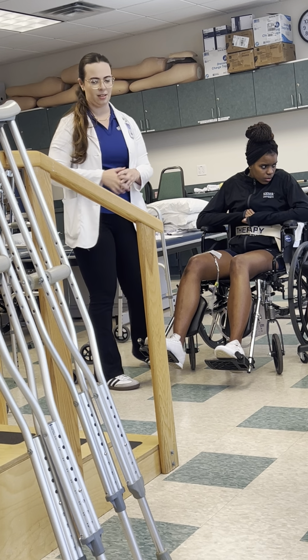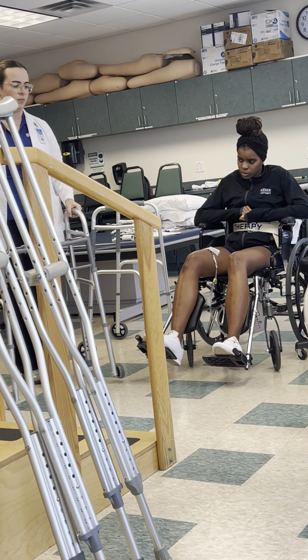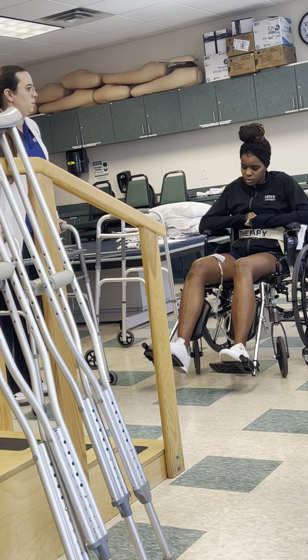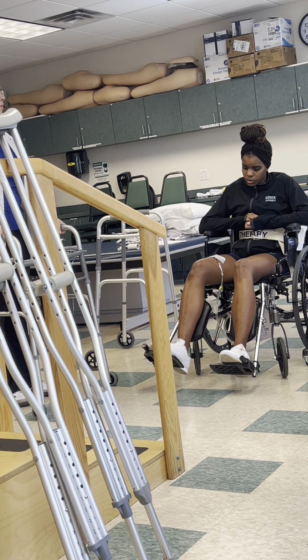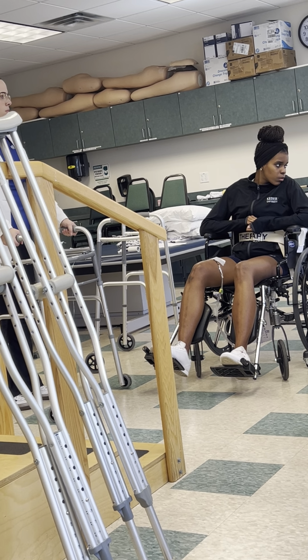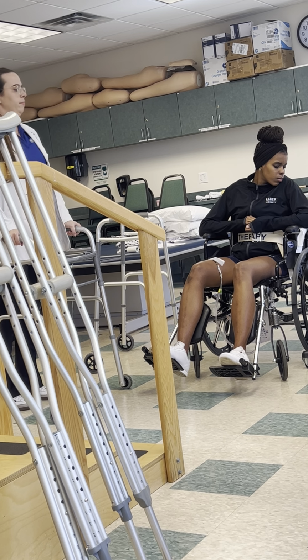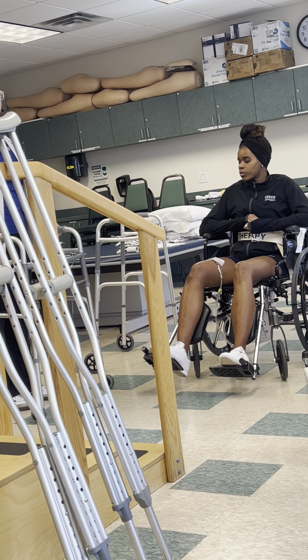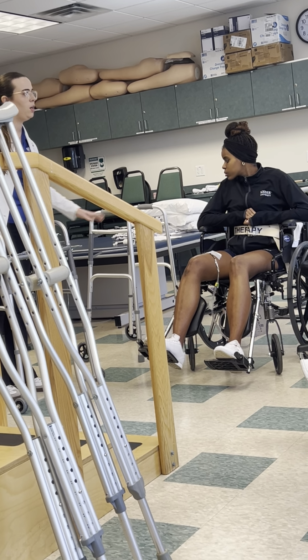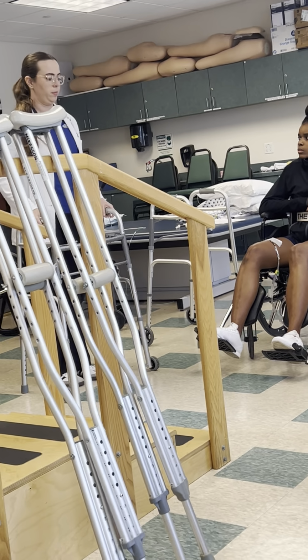And then the next, using his or her own assistive device, demonstrate the correct gait pattern and weight bearing status on the stairs. You explain the patient's weight bearing status. If the patient is non weight bearing, remember the patient's involved lower extremity should never touch the floor. If partial weight bearing, educate the patient on how much weight to put through the involved lower extremity. So here I have two assistive devices, my own and the patient's. When I'm demonstrating, I will demonstrate on my own, okay?